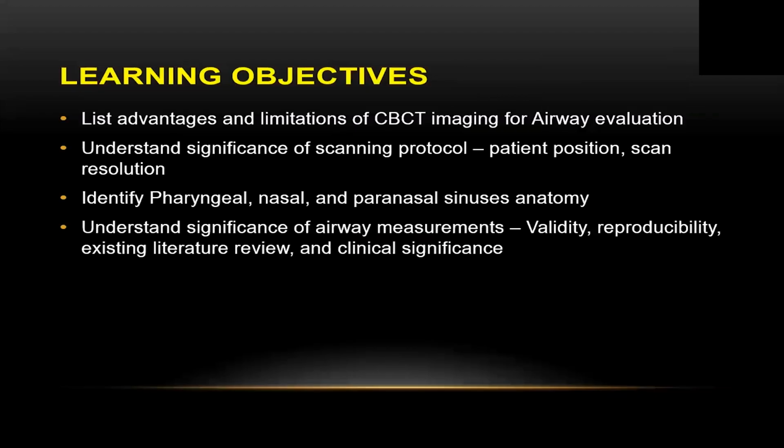Learning objectives that we have selected or identified for today's webinar, we'll look at advantages and limitations of imaging for airway evaluation. We will have a discussion on scanning protocol. How should you position a patient? What are the effects of scan resolution? And which scan resolution or setting should you be selecting if you are trying to do airway evaluation? We will also briefly review anatomy, which you will see when you are looking at airways.